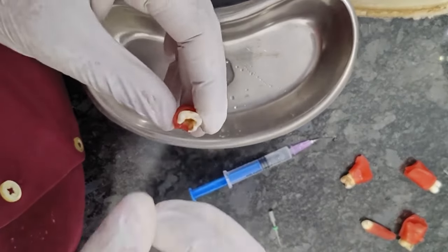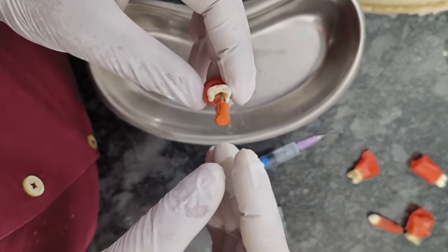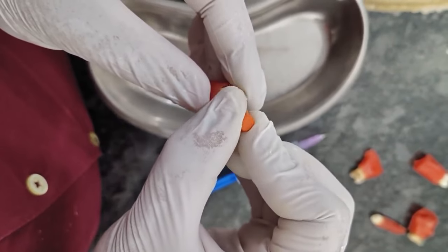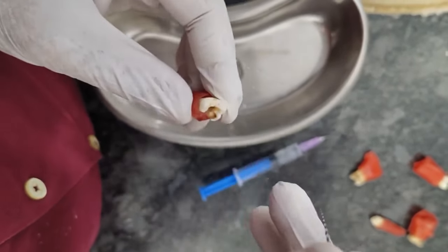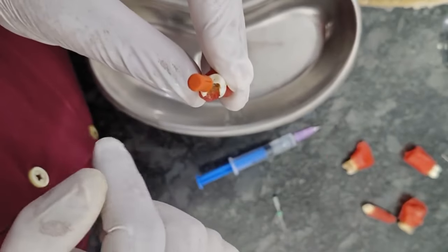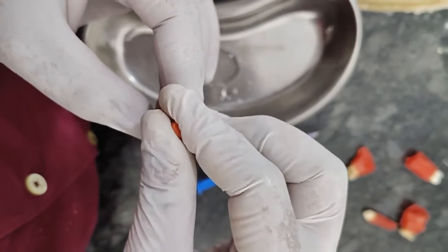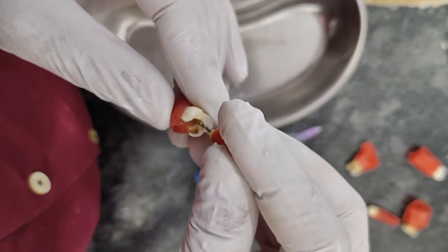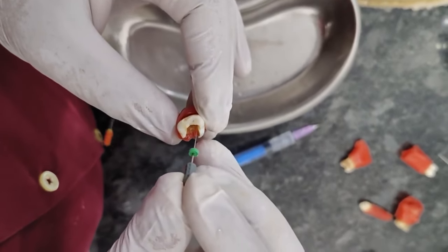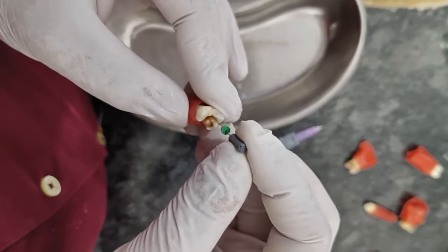So after irrigating, we have to use the SX file in order to flare the canal or the coronal. So how will you use the SX file? We have to rotate it 360 degrees and reverse 90, pull. Similarly, in the distobuccal canal, see that this is the angulation for the distobuccal canal. Rotation of 360 degrees, reverse 90 degree, 360 degree, reverse 90 degree, and pull. And the palatal canal also, similarly, we have to rotate it 360 degree and 90 degree pull. So this way we can enlarge the coronal orifice and start our root canal BMP with different file systems.